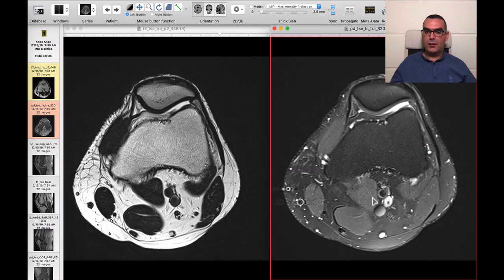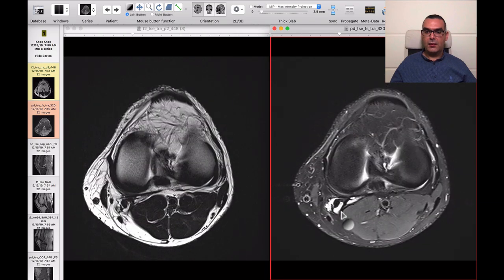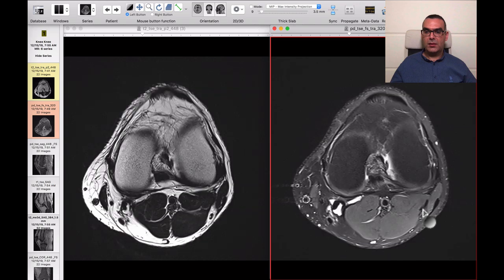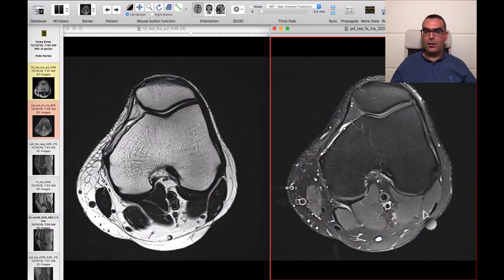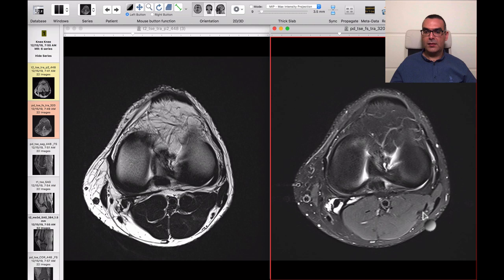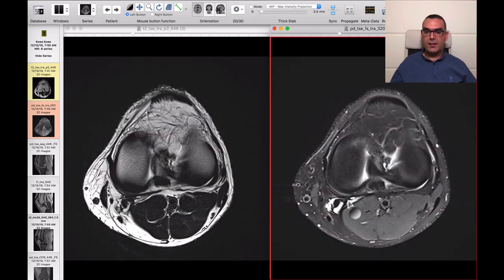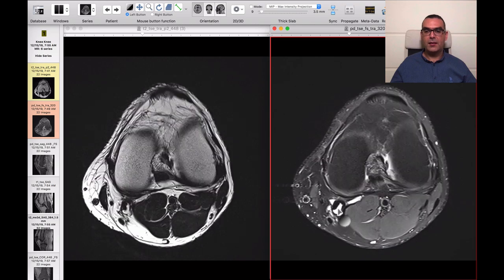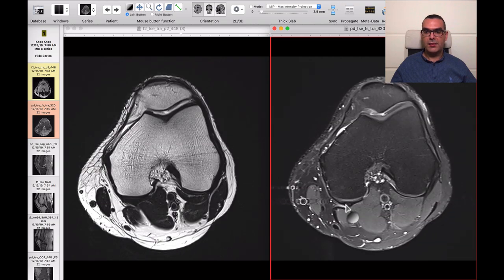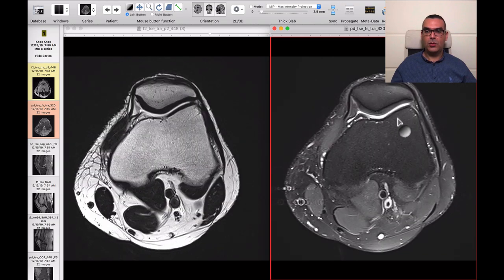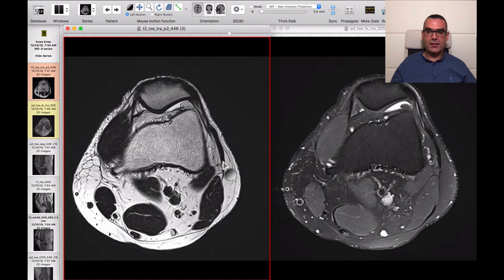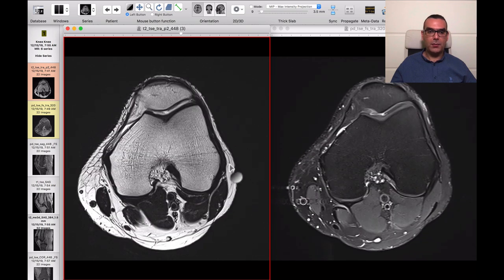Let's take a look at the other structures — the muscles, tendons, and marrow. There is no marrow abnormality; all muscles and tendons look good. We see here a small multi-loculated cyst insinuated between the semimembranosus and the medial head of the gastrocnemius — that's a small Baker's cyst — and there is a mild amount of joint effusion. No other definite pathology on the axial scans.